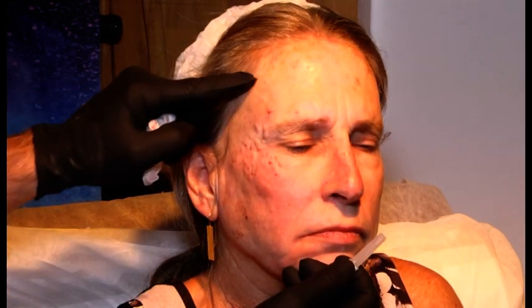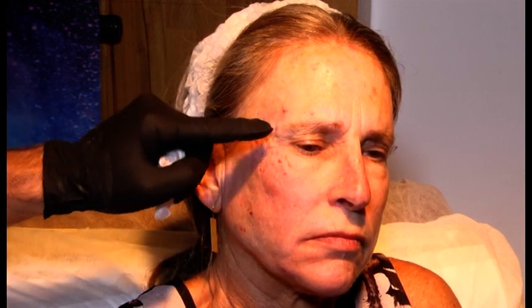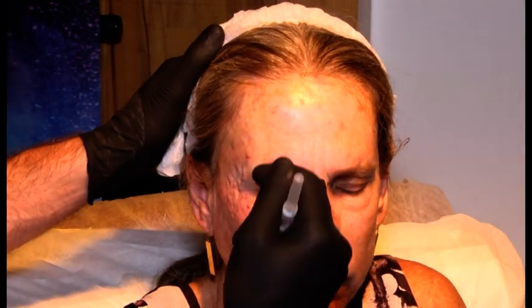All right, so what we've done, temple, volumizing the temple. You see depression over here, correction, skin quality improvement with Radiesse on the cheeks. These little bumps are Belotero Revive. They're going to improve the skin. The bumps are going to reduce. We've augmented the chin, gave her more projection over here, reduction of the mental crease, pushed the oral commissure up. And we have, first of all, created the nasofrontal angle. And second of all, we have made a sharper light reflection of the nose.